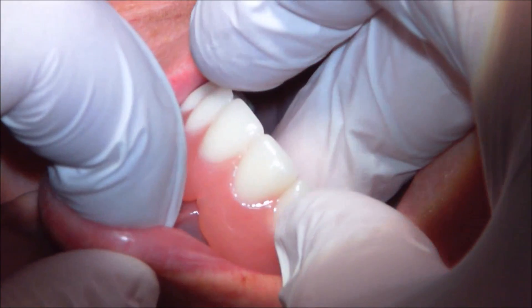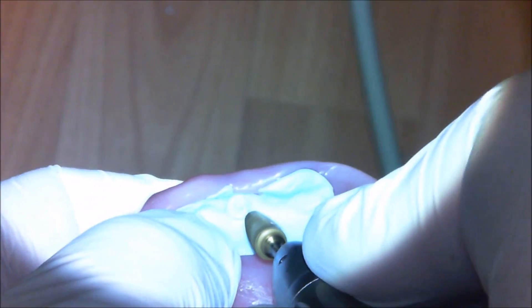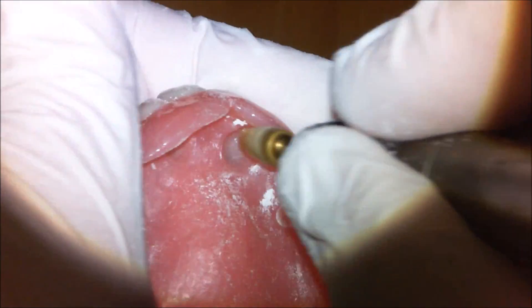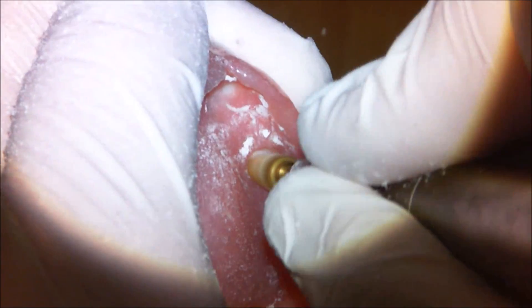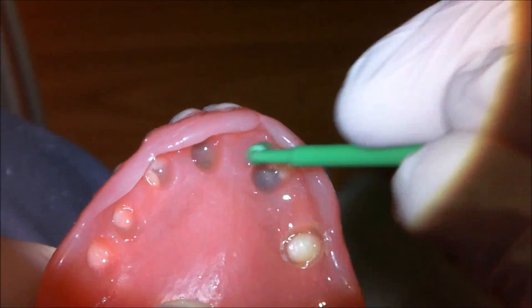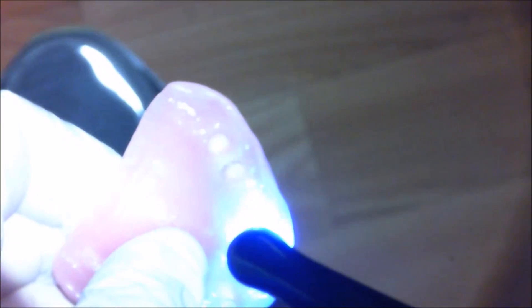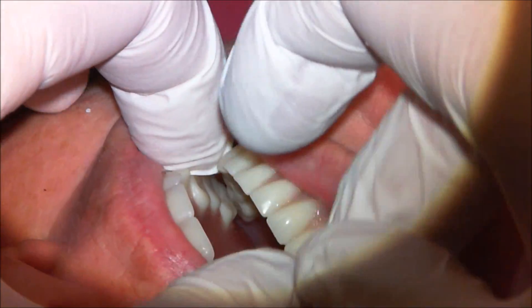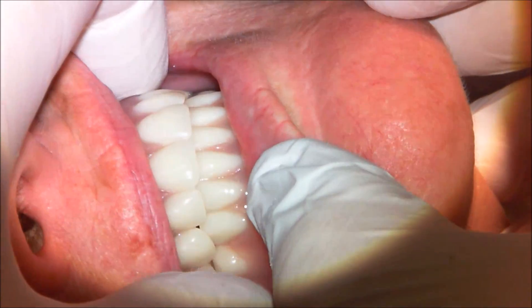I need to relieve her denture now. I squirt some bite registration material into the denture and seat it in the mouth — this provides marks where those healing abutments are. Then I take a slow-speed handpiece and make perforations into the denture through the bite registration material where I see those healing caps protruding. This allows us to confirm that everything is sitting passively and the denture is not binding on one of those healing caps, which could cause unnecessary or off-axis loading during the healing period. Then I reline it using easy pickup material, injected after placing a light-cured varnish to allow bonding to the acrylic.